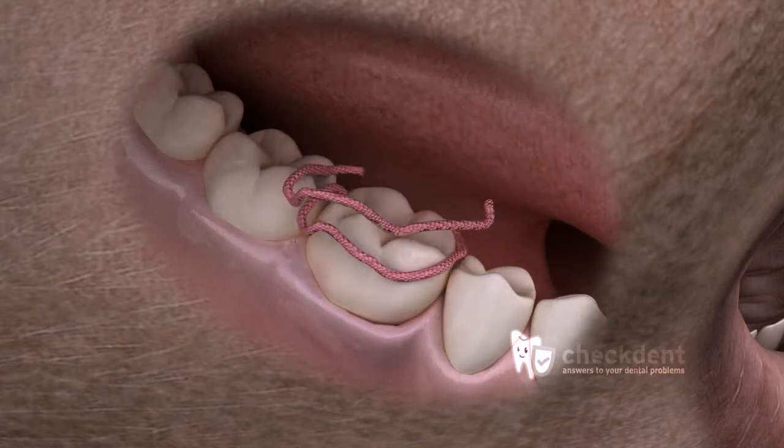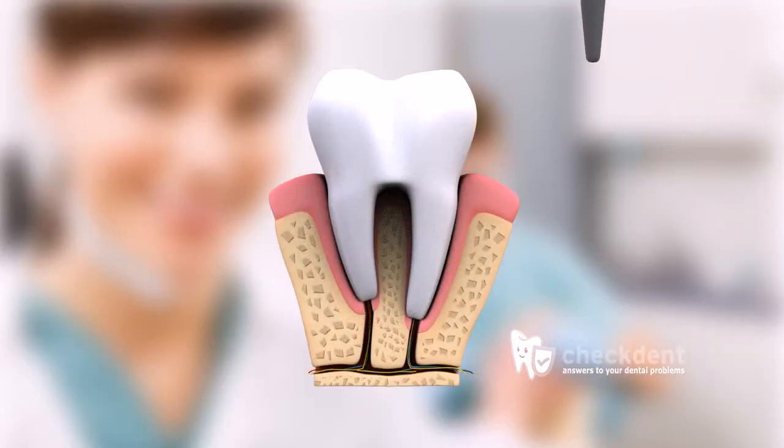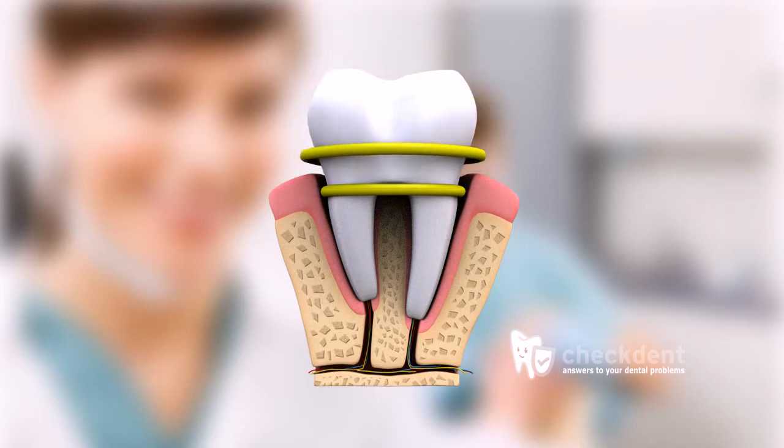Why are gingival retraction cords necessary? First, because the gingiva must not be cut, and second, because the preparation margin should be placed in the so-called sulcus, in effect below the visible border of the gingiva. The first gingival retraction cord deflects the gingiva to one side in order to avoid injury while cutting. It also ensures that the preparation margins are placed in the sulcus.